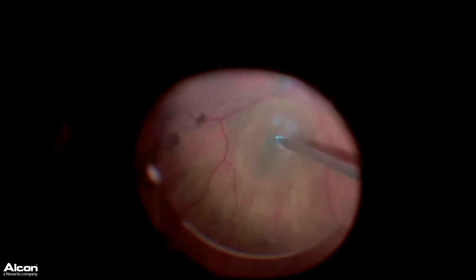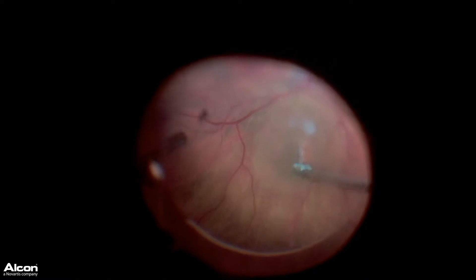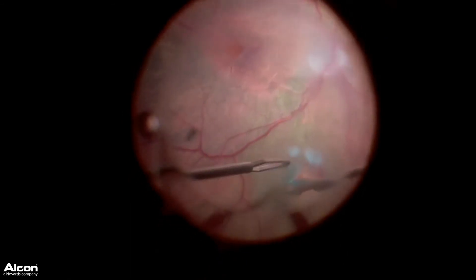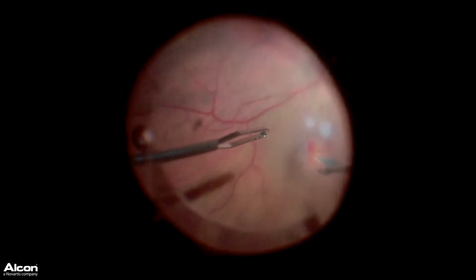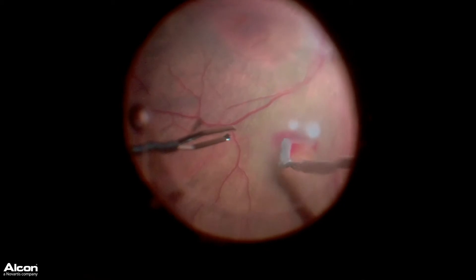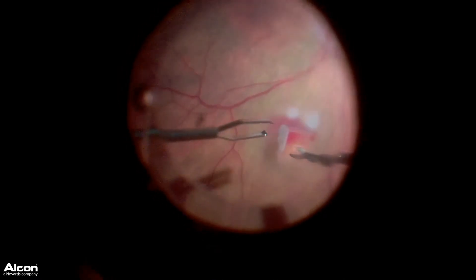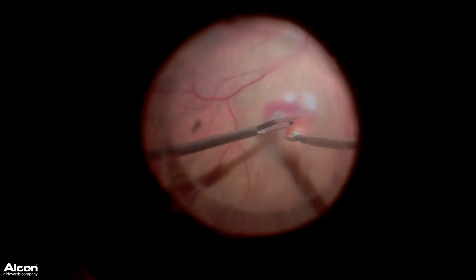I then utilize the Alcon curved scissors to create about an 80% circumferential cut of a nice macular graft. Here we can see I've stained the ILM so that I keep my orientation with the ILM anteriorly. We're able to utilize a bimanual technique to help retract back this retina so that I can get under and trim it to the point at which we've got about two clock hours of attached retina to hold it in place.